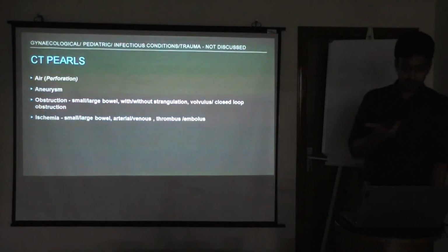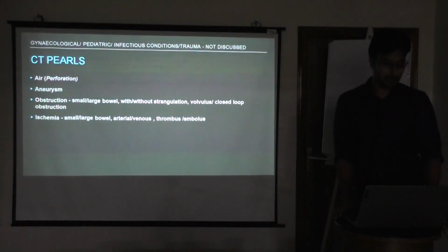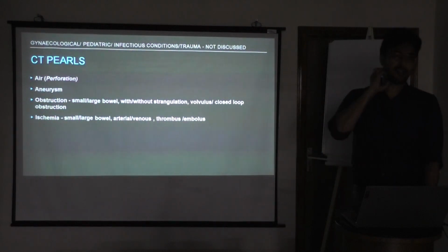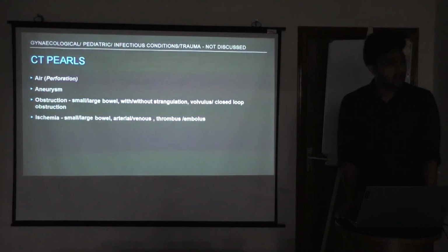So today, as you know, CT is a vast topic. I'll just describe these four things. Air: for surgeons and medical gastroenterologists, there is a misconception in society about flatus, but for us flatus is a dream. After the surgery, if the patient passes flatus, we all say, happy, you can go home.